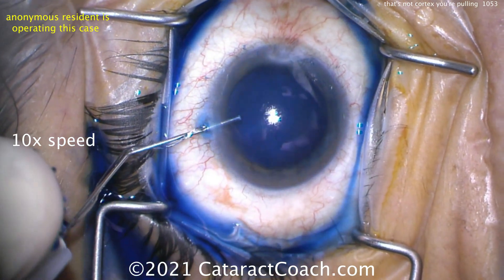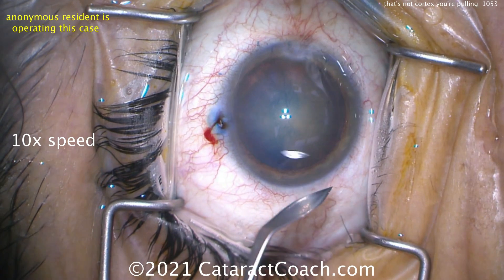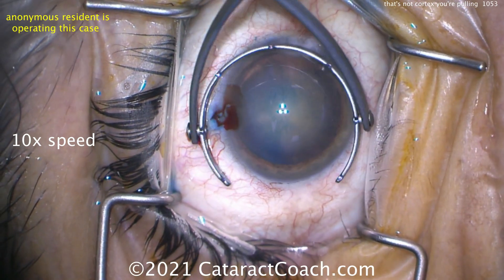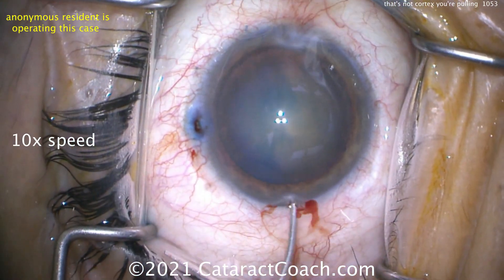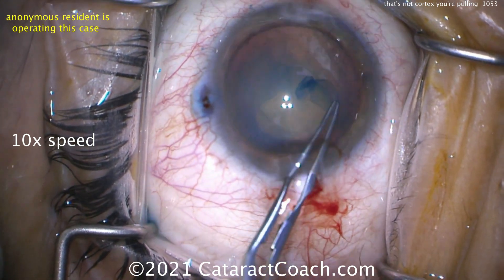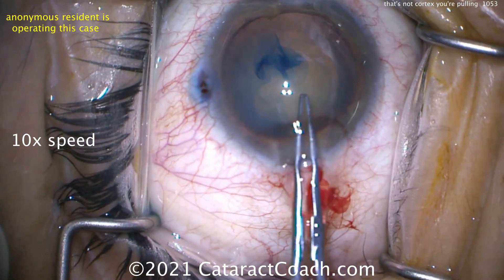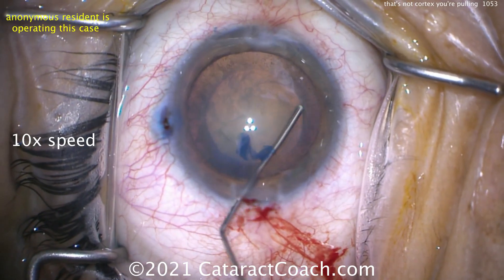We'll watch it at 10 times normal speed to be efficient. There's our viscoelastic going in, a little tri-pan blue dye for the capsule. Let's look at that incision — looks pretty nice. And there's the rhexis. This resident has done about 100 cases so far. Getting that rhexis done, nice and round. That's a beautiful rhexis. I give that one an A. Good job.